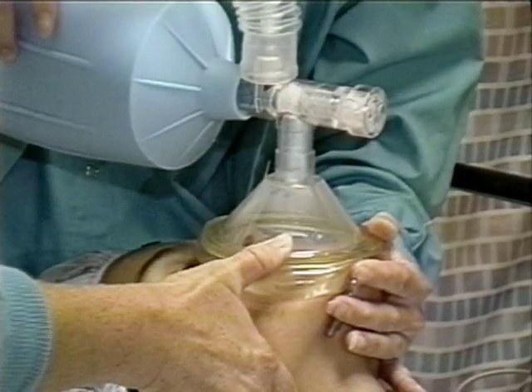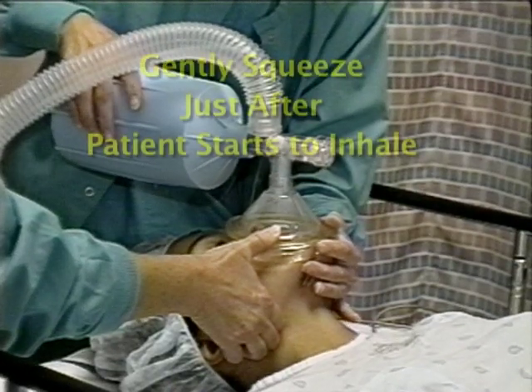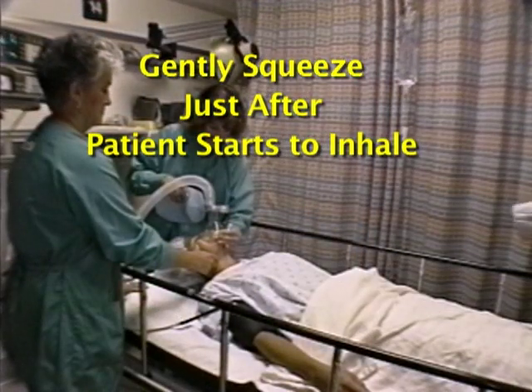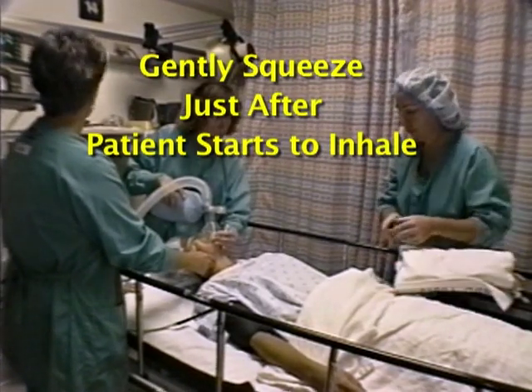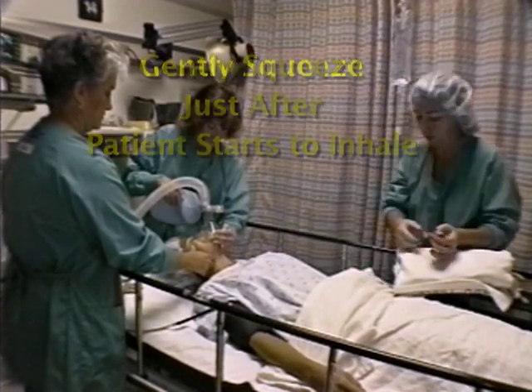Sometimes you may need to assist the ventilation of a patient who is breathing spontaneously in order to improve their tidal volume. Gently squeeze the bag just after the patient starts to inhale. The airway is most open at that point and the resistance least. The breath you deliver should continue to expand the patient's chest for the few seconds after he stops inhaling.